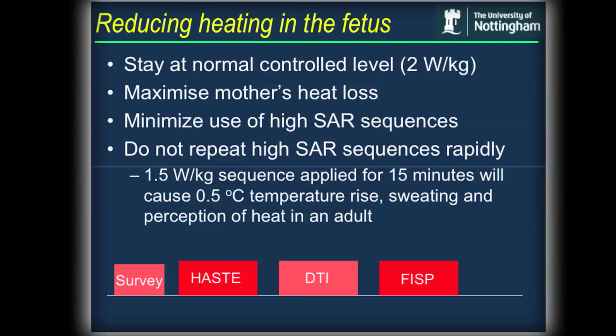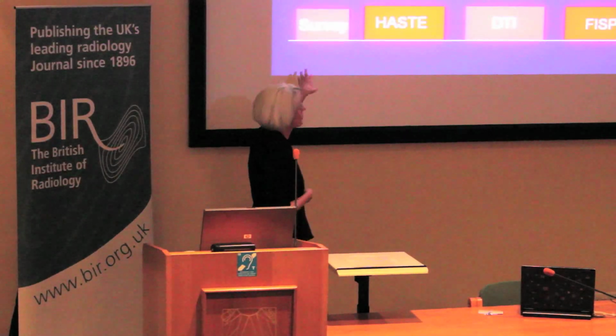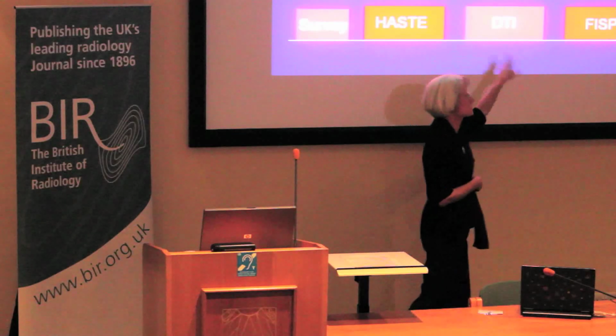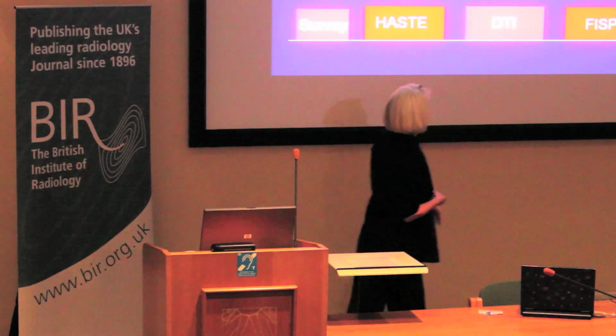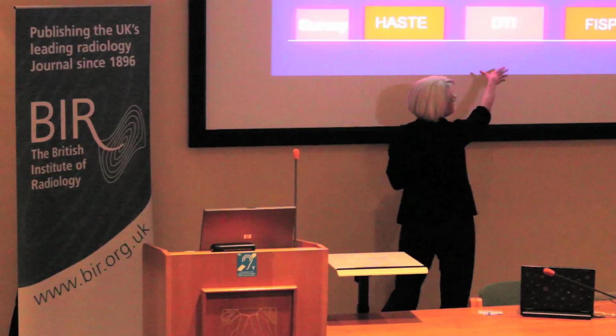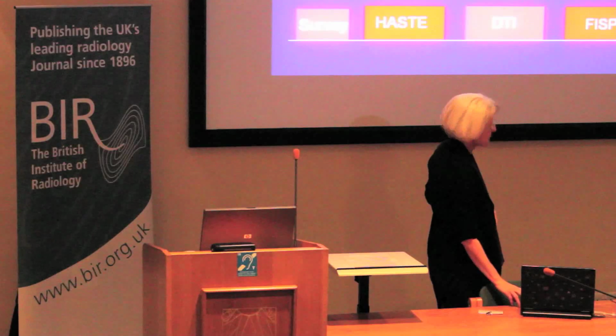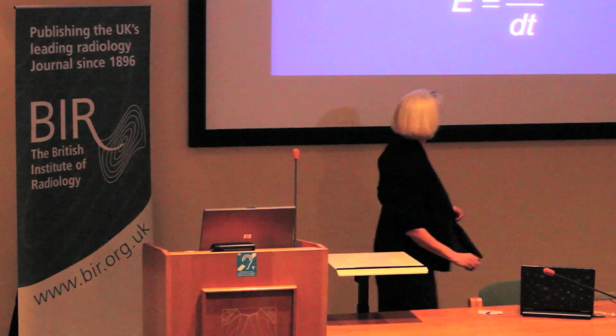And we try to arrange imaging protocols as far as possible to not do all the high SAR sequences together, at least ideally. So if you mix up the survey scans, the HASTE scans, the FIS scans, the DTI, the EPI scan, then you're going to have a time period where there's low SAR, low power deposition, interleaved with periods of high power deposition. So there are things you can do to mitigate heat deposition.